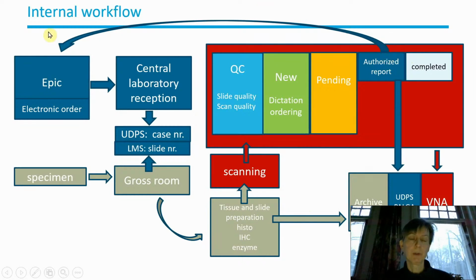The electronic report goes back to the electronic patient system, but also into our national database, where it can be retrieved whenever or wherever the patient is seen within the country. And the digital images then are stored so that, as long as they are in storage, we can always retrieve them within seconds when we need them again.